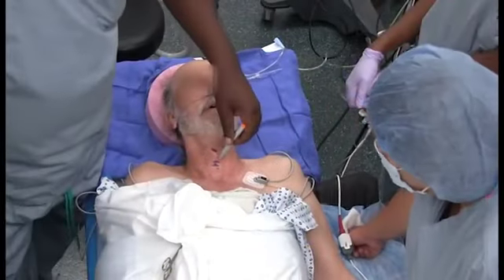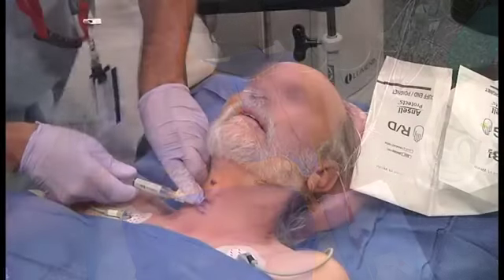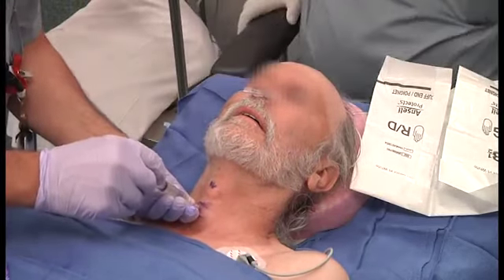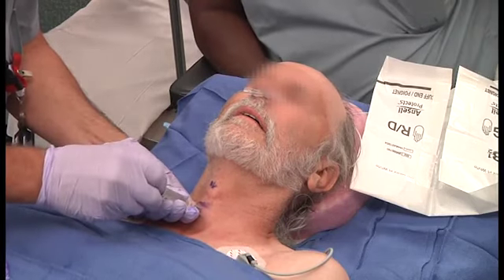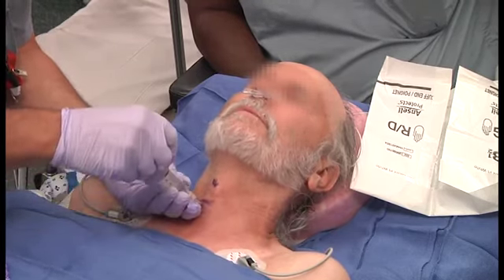A local anesthetic skin wheal was made over the surface landmarks of the cricothyroid membrane. The same needle was used to identify the cricothyroid membrane and aspirate air from the larynx. Local anesthetic was injected into the larynx at this time.